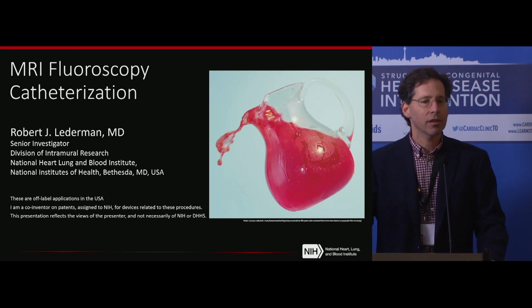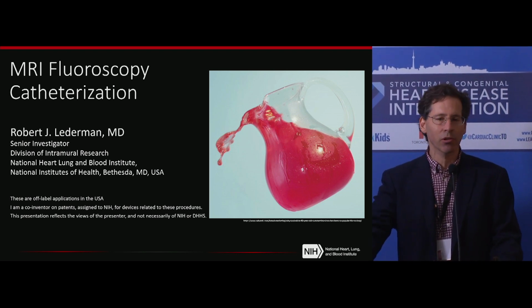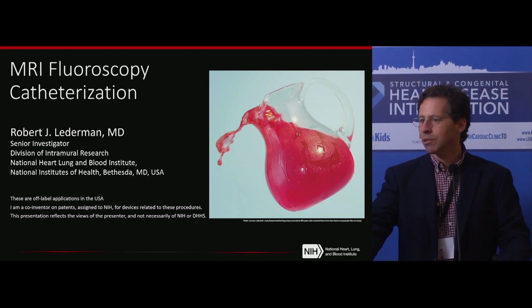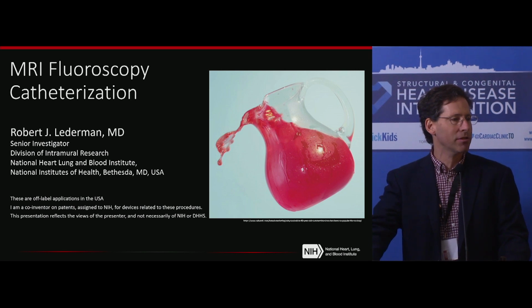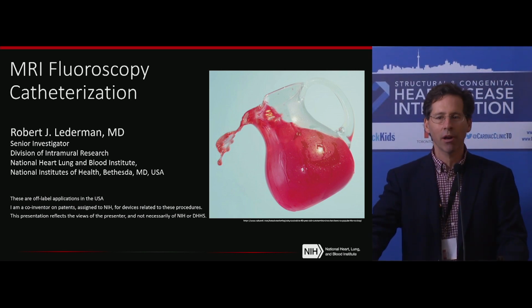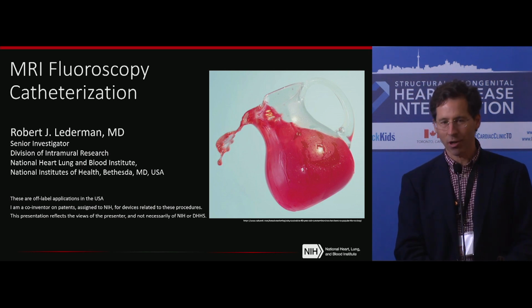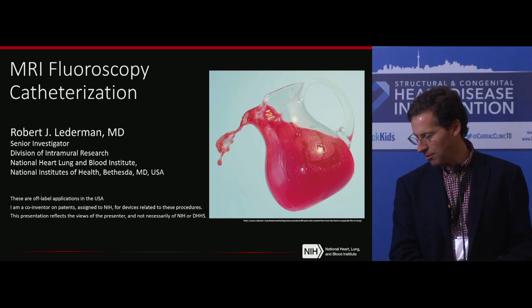I'm going to talk about using MRI for catheterization in patients. It's still very early. We've been real plodders in making progress. But one cool thing that I won't mention after this introductory slide is when you're doing catheterization in the magnet, you don't have to wear lead. So if lead is your problem, this might be one element of the solution.